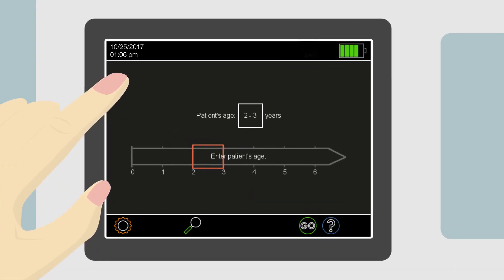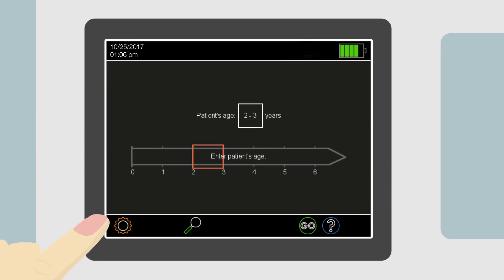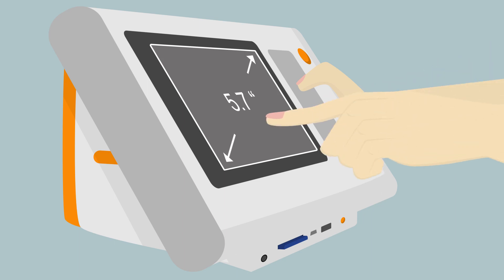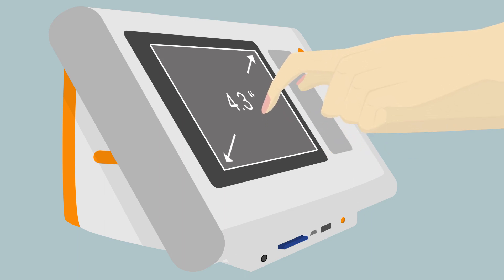The screensaver and auto shutoff timers can be adjusted on the settings page. The PlusOptics S12C model has a 5.7 inch capacitive screen, meaning it will respond to the skin of your finger or a stylus touching the screen. The PlusOptics S12R model has a 4.3 inch resistive screen, meaning it will respond to the pressure of your fingernail or a blunt pen tip touching the screen.